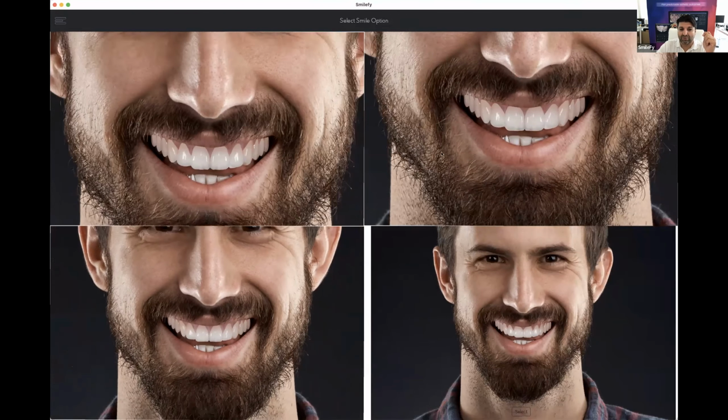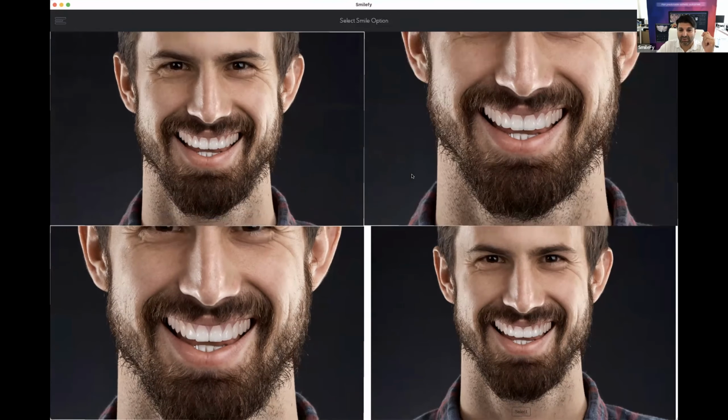So, dear patient, do you see the advantage of an aesthetic treatment? Yes, I see. What kind of shapes do you feel would represent you as a person, you as a character, right? And then the patient says, that's too round, I'm not sure, but I see myself in here. Triangular shapes, edgy, I like it. Let's continue the discussion by clicking select, and we get the triangular, square, embrasure shapes for our patient.